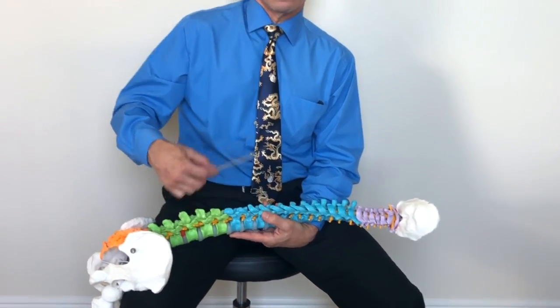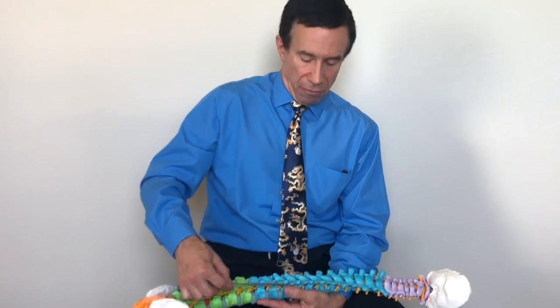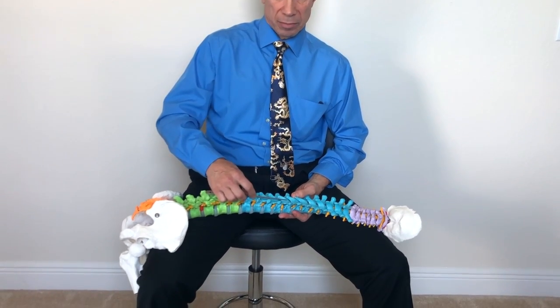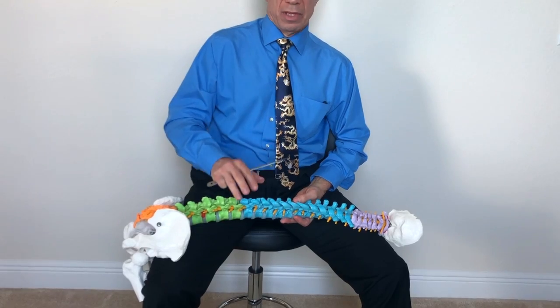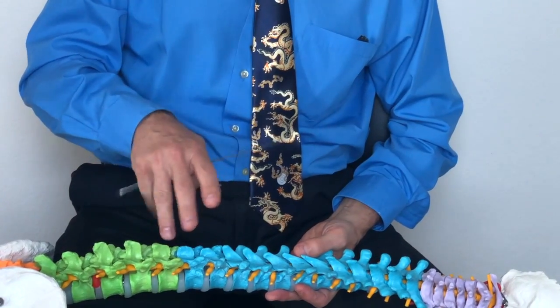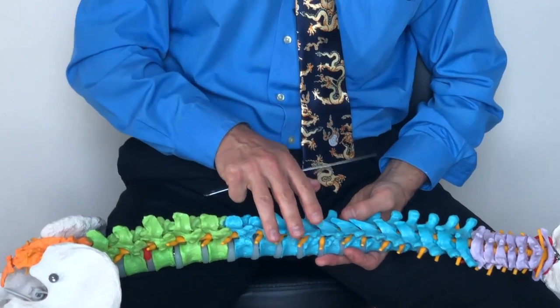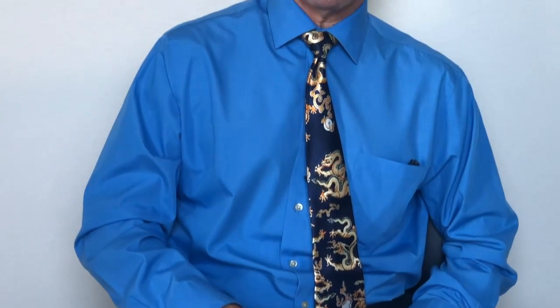So, once the stimulation is found to be appropriate in terms of location and appropriate in terms of blocking at least some of the patient's pain, the needle is very carefully removed, leaving the electrodes in place inside the spine. Then, heavy tape and adhesive are applied to the skin in order to hold the electrodes in place. The patient is then sent home with instructions how to operate the device and a prescription for an antibiotic in order to minimize the chance of infection.